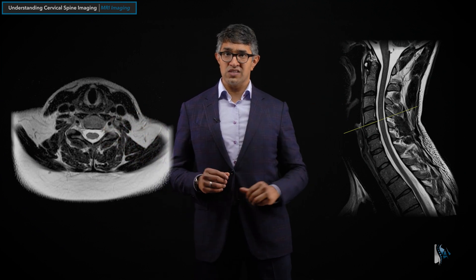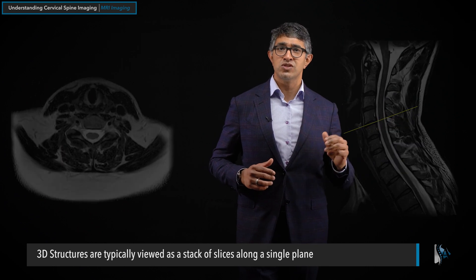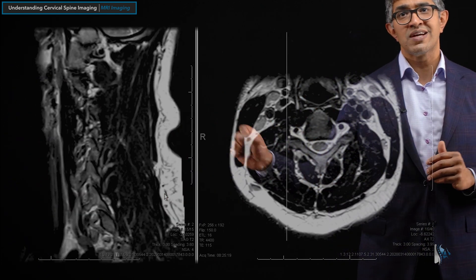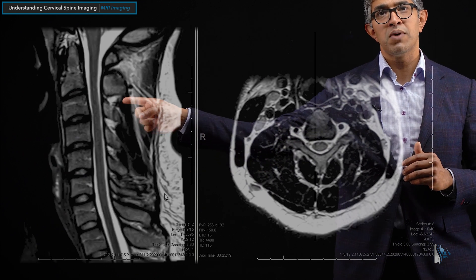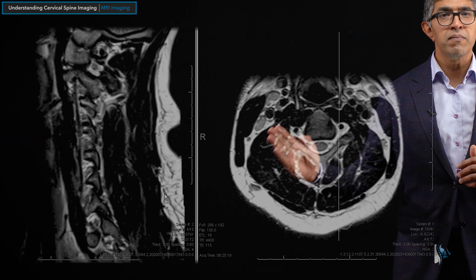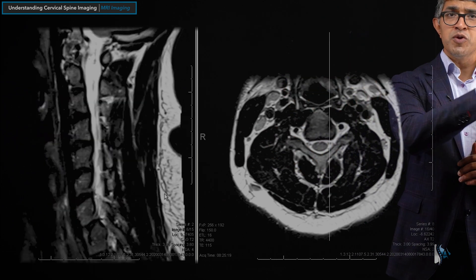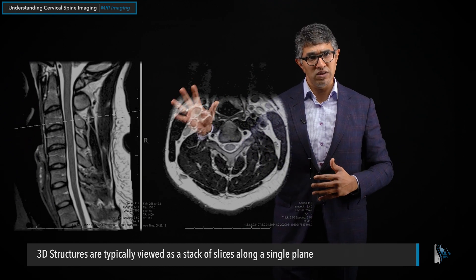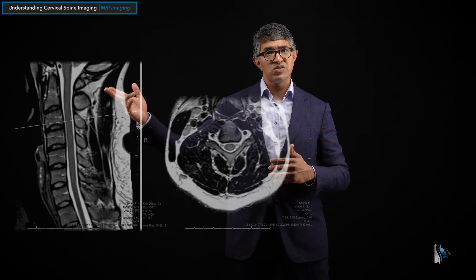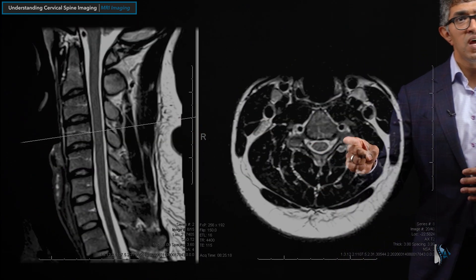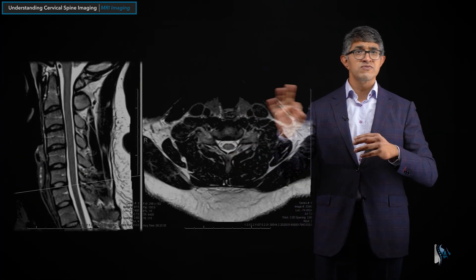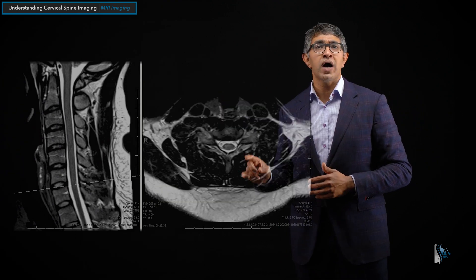Neither of these sequences are single slices. When looking at an MRI scan, we're looking at stacks of images. In the sagittal T2 sequence, a line tells you where that slice is — you can see joints in the back, the spinal cord, the spinous processes — and you can march from left to right through the axial sequence along multiple slices to understand the anatomy in three dimensions. Similarly, you can get axial sequences and roll through them: you'll see the spinal cord, the nerves on both sides, and check everything one level at a time through the full stack of sequences.